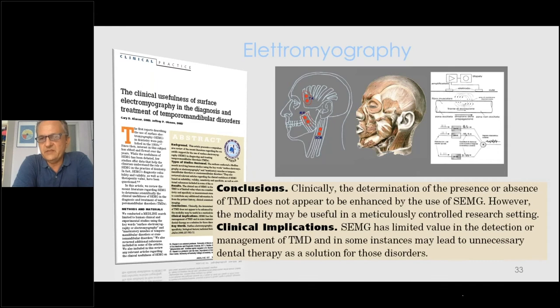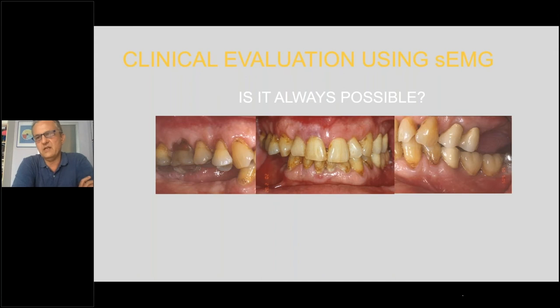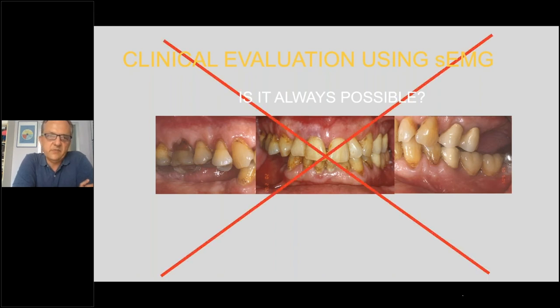Well, this shouldn't be such a big surprise, because when we deal with temporomandibular disorders, the diagnosis is more clinical than otherwise. And also, when we deal with these patients, of course we have to deal with the clinical aspect more than how the muscles behave. So we're reaching a point where we can deal with the clinical evaluation of surface electromyography. First of all, is this always possible? And the answer is clearly no, it is not always possible. And this is because if we are deviating a lot from the norm, then it really doesn't make much sense to do such an exam, because the reference will be distorted.